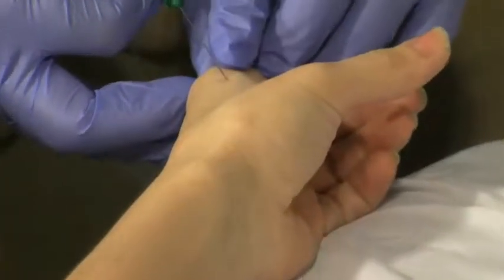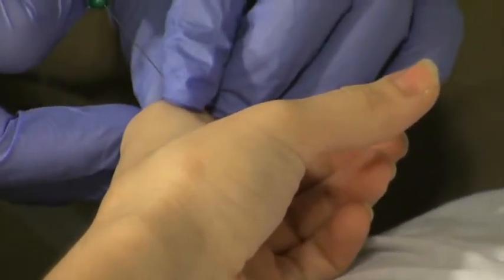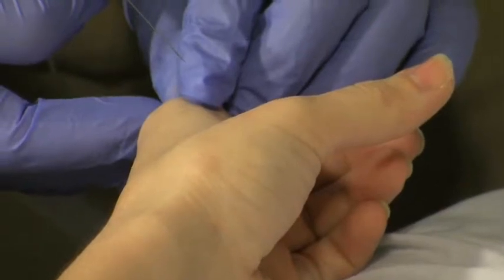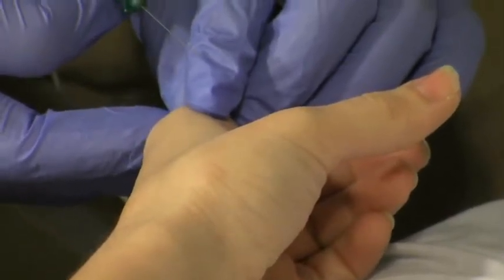So here we go. You're going to feel a stick here. By the way, the stick hurts only when it penetrates the skin. Once inside the muscle, it's going to feel like pressure.